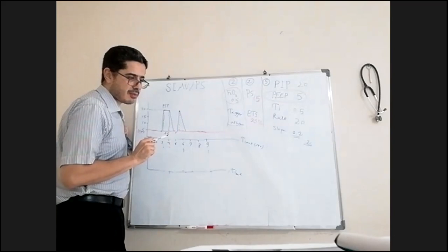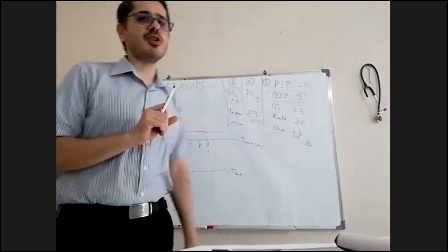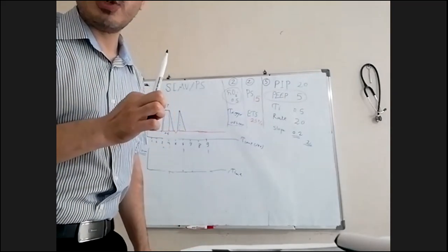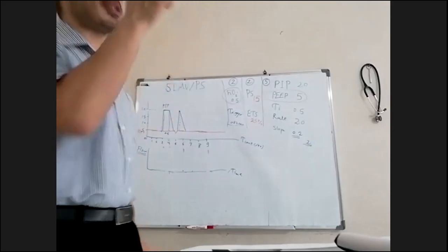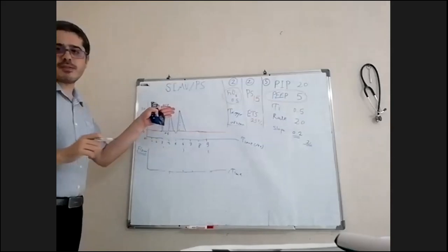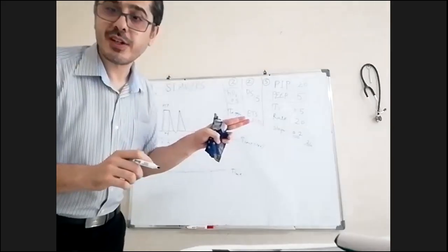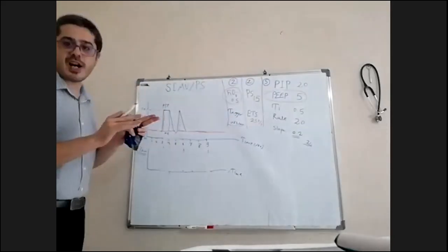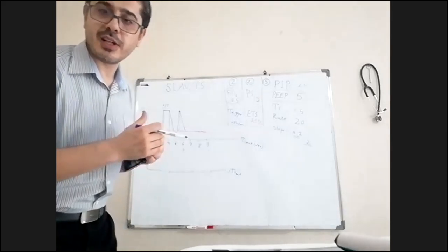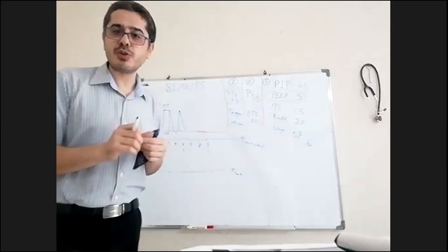Assisted. It is spontaneous breathing. The term assisted breathing is when you get the full assistance: you get the pressure and you get the TI. That is assisted breathing. But when you get only pressure support, it is still considered spontaneous breathing.